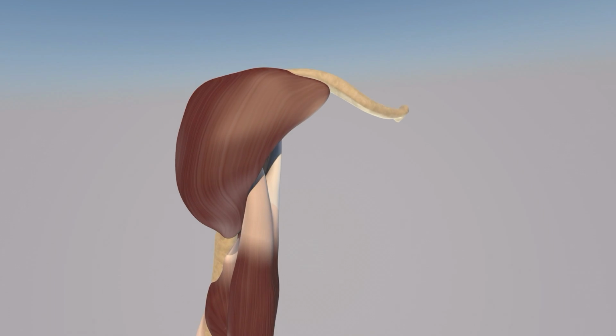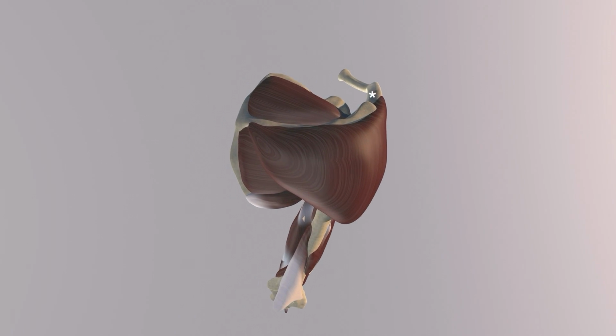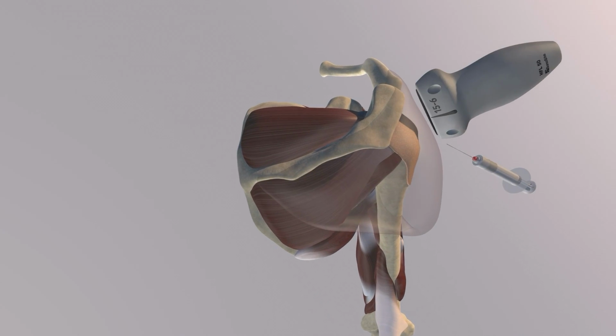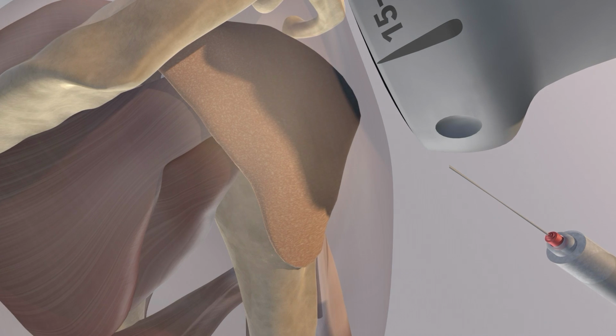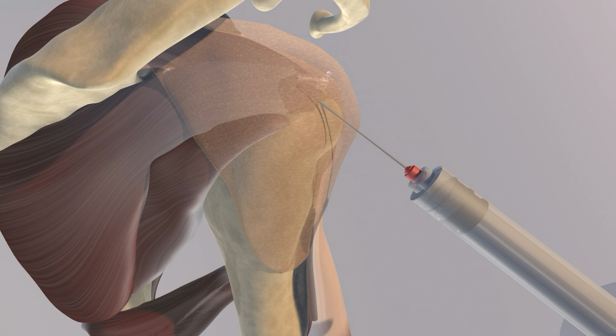Here we're going to go over the subdeltoid bursa injection. Here we can see the deltoid muscle with origins from both the clavicle and the scapular spine. You can see how it overlies the infraspinatus and teres minor muscles. Now we're making the deltoid muscle translucent. We can see this fairly broad bursa, which is the subdeltoid bursa, which is the target of this procedure. This is an in-plane approach, and here we are essentially going right into the bursa, and here we are continuing with the injection.